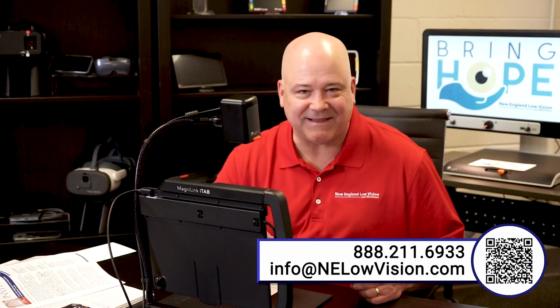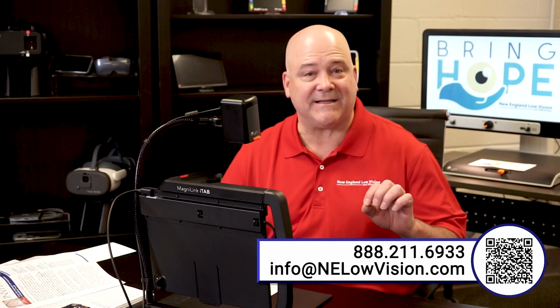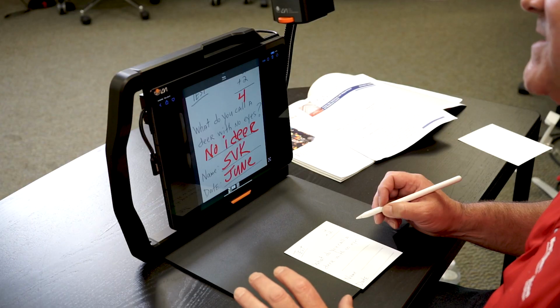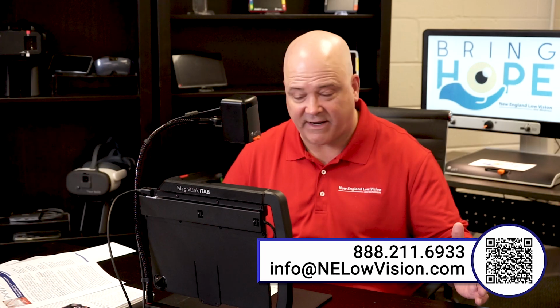Then we can email that in to whoever is going to be the recipient of the document. So what's nice about the iTab, the MagniLink S, and the MagniLink Tab for the PC is that you can edit the documents and then send them away to somebody else.